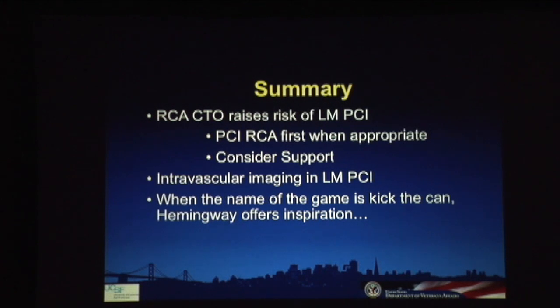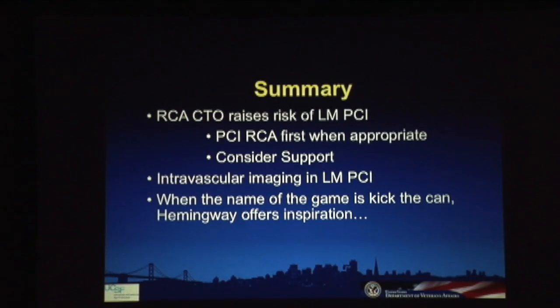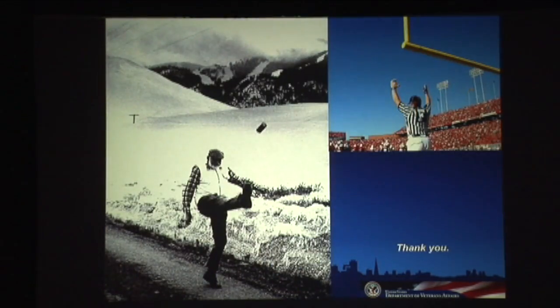So to summarize the case, the CTO of the right coronary definitely raises the risk of a left main PCI. I put this comment in not knowing you were going to show a case to illustrate the point, but sometimes you can do PCI of the right first when appropriate to make it safer to do the left main, and then you should consider support. Intravascular imaging, I think, is also really important in left main PCI. Make sure you've got the struts apposed and you understand where the plaque is. And then when you see that people are playing the kick the can game, you can look to Hemingway for some inspiration. And here's a picture of Hemingway kicking the can.